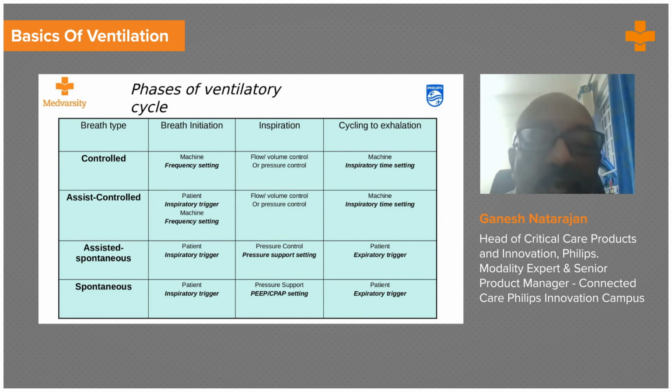Now, spontaneous, as the name itself suggests, the patient starts the breath, the patient ends the breath. The quantum of the breath is completely the patient's own. But even in spontaneous, you could have either a pressure support or a volume support.